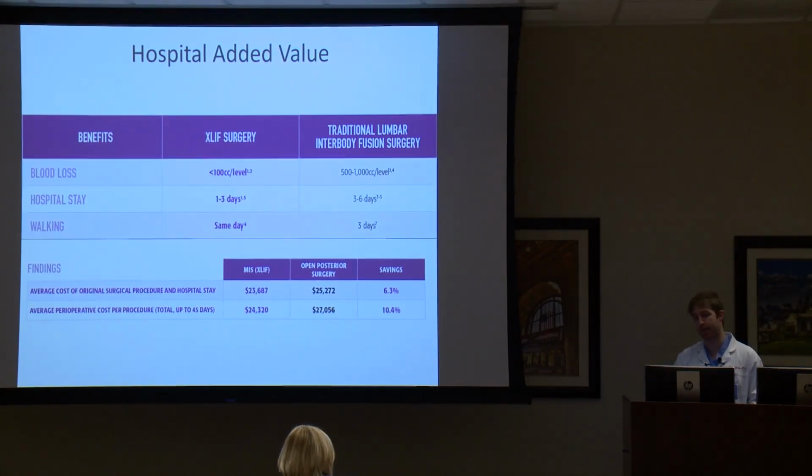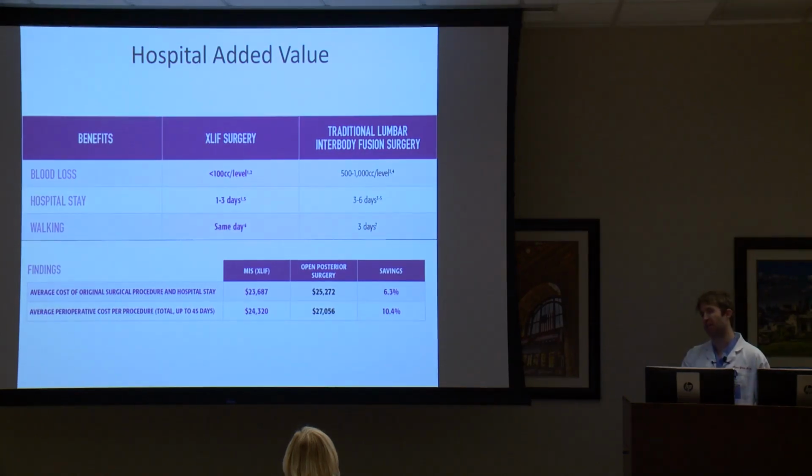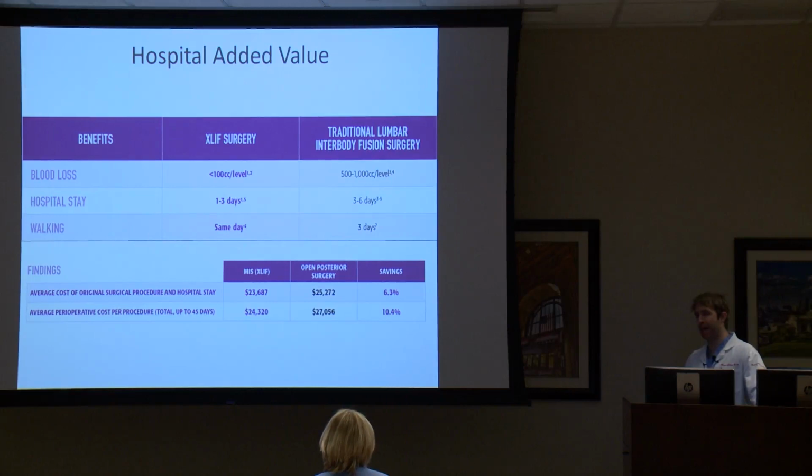So again, the reason it says XLIF on here is some of these slides are from NuVasive because they've got the best data on it, but don't be fooled. XLIF, lateral, DLIF, they're all the same. So you can see that the top things are blood loss, obviously, and hospital stay compared to your regular TLIF, or doing everything from the back and putting in a cage, is about 1 to 3 days versus on average 3 to 6 days. I would say that a TLIF nowadays is probably more 2 to 4 days rather than 3 to 6.